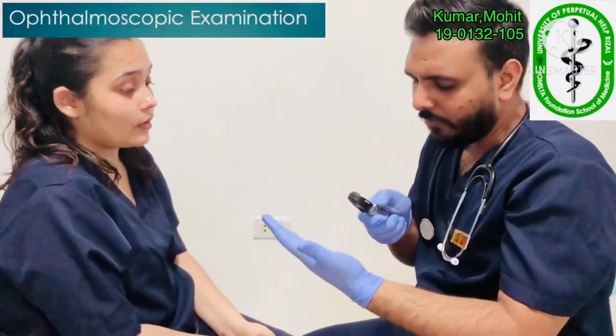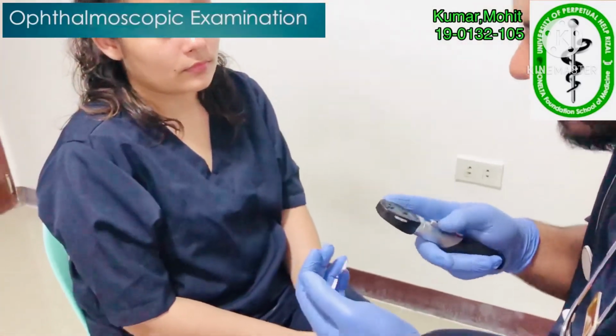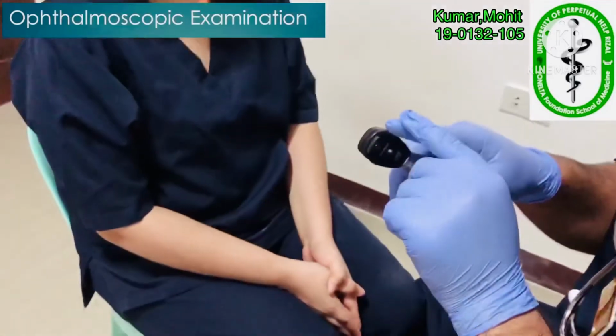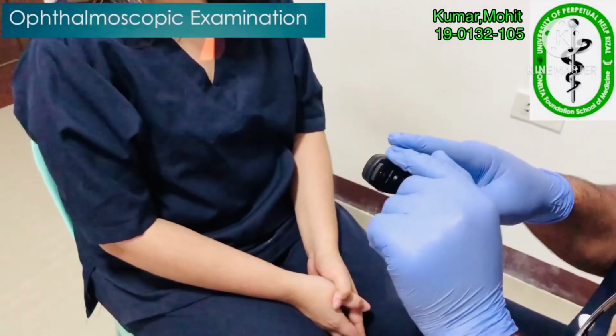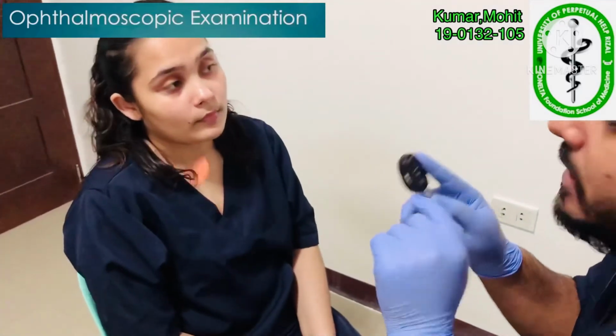So this is our ophthalmoscope, and now we have to adjust it to 0 diopter, and it's on 0 diopter. Our index finger should be at the diopter adjustment here. We can adjust our vision from here. And now we have to focus this light inside the eye of our patient.